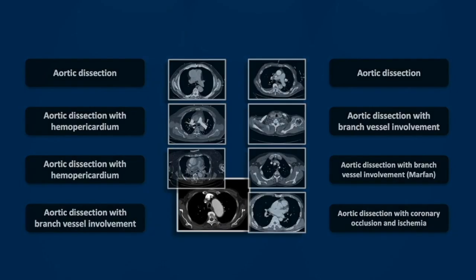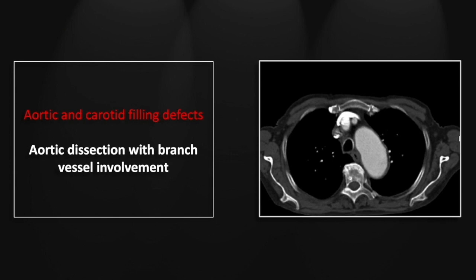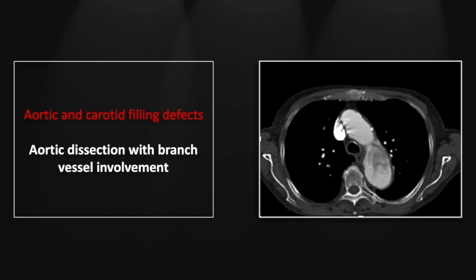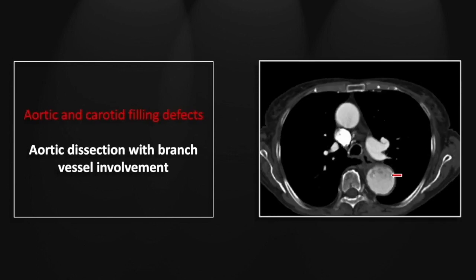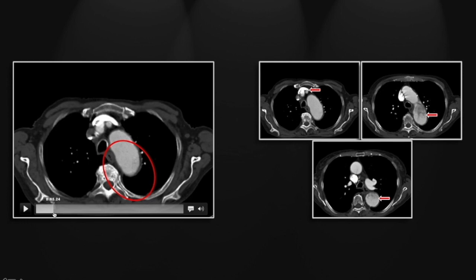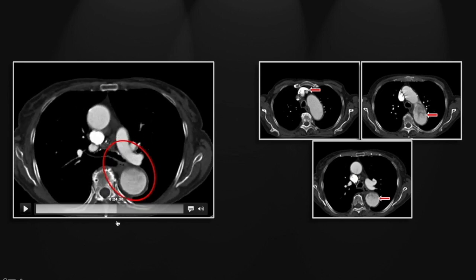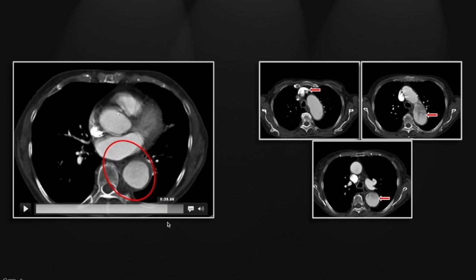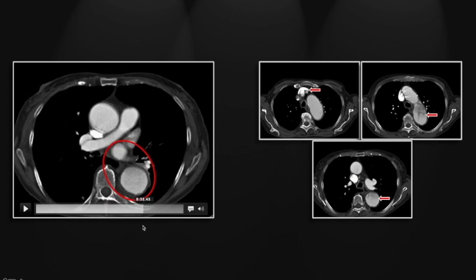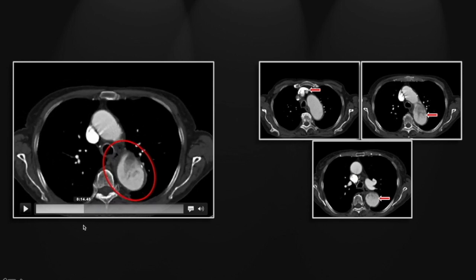Our next case is an aortic dissection with branch vessel involvement. You can see it at the base of the left common carotid artery. In the posterior aspect of the aortic arch there is a wispy filling defect representing a thin layer of displaced intima, and that extends into the descending thoracic aorta where you can see a tiny fleck of atherosclerotic calcification displaced in the lumen. This dynamic filling defect extends throughout the descending thoracic aorta with a swirling appearance as it moves with blood flow.